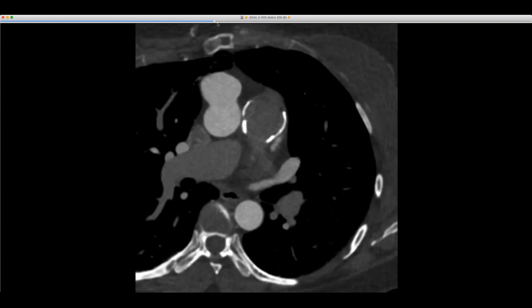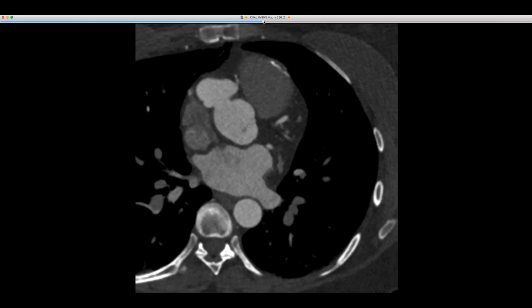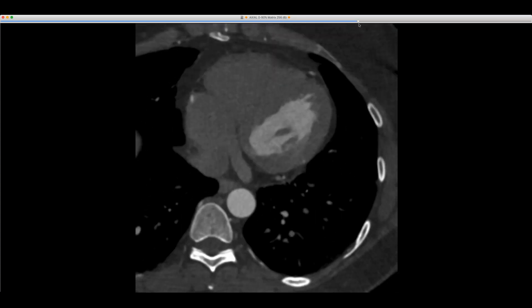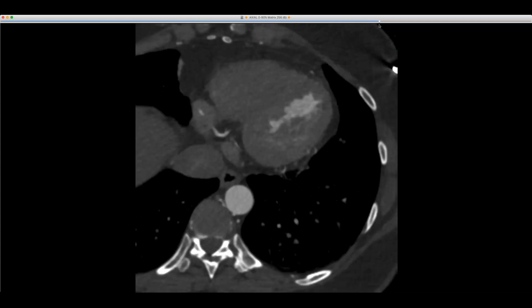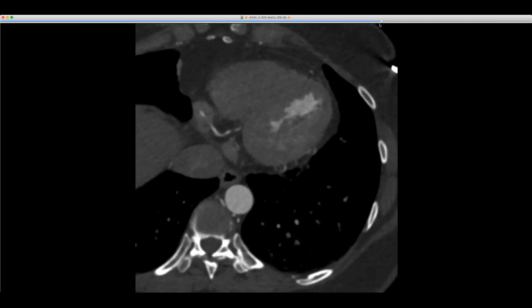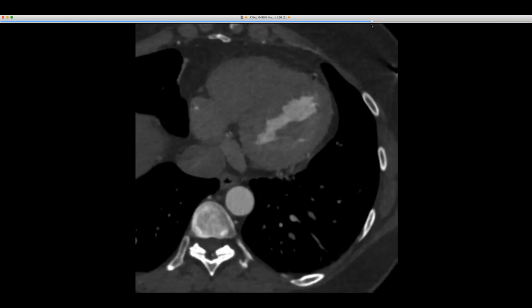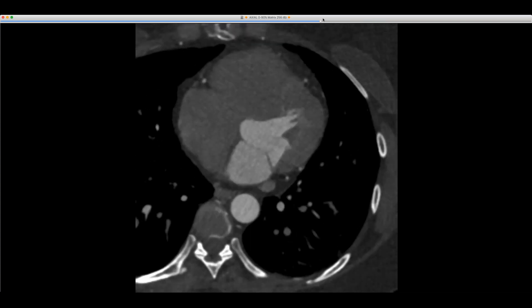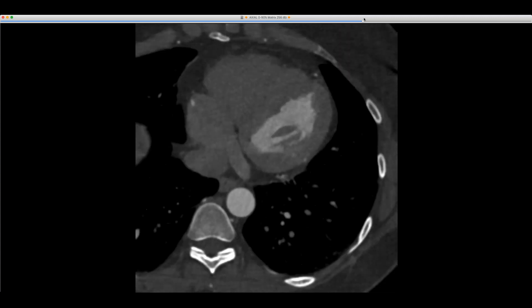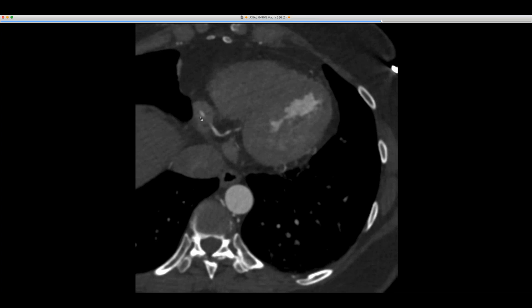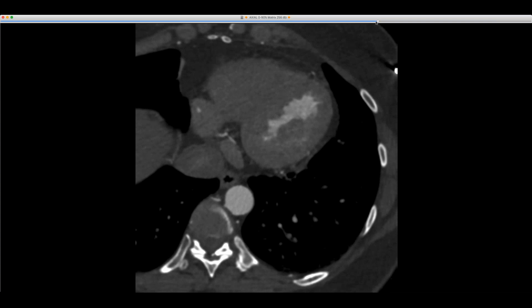But that's not all. Art Stillman called me and said, did you see this abnormality? Here's the RCA — look where it's running, right through the right atrium. We see these intracavitary courses of the RCA commonly through the right ventricle, but this is the first one I've seen running through the right atrium. Just right smack there — intracavitary course of the RCA through the right atrium. Nick Goyle said he had seen a couple of those before, so they must be out there, but that was the first one I'd seen. Just a dramatic case for a couple of different reasons.